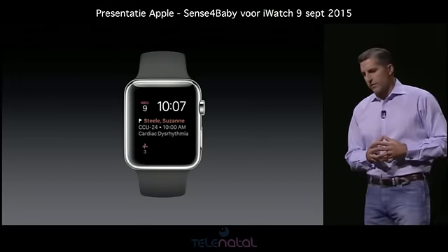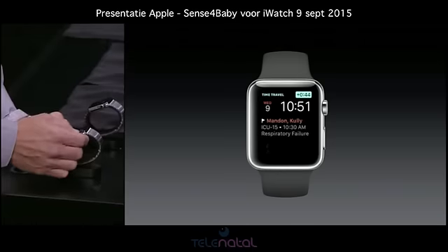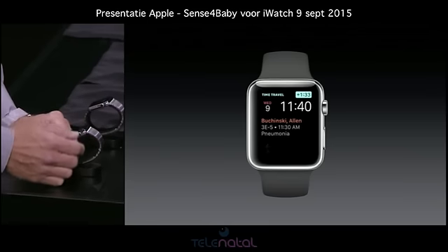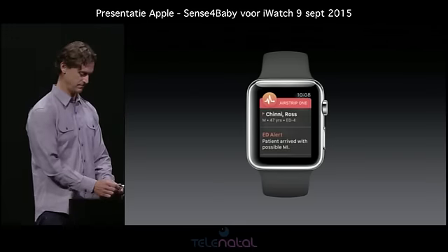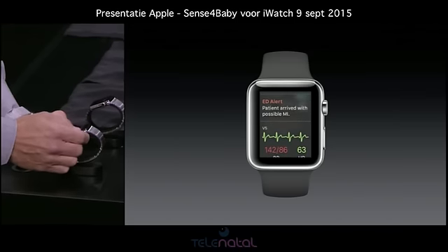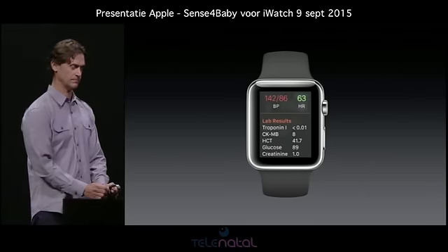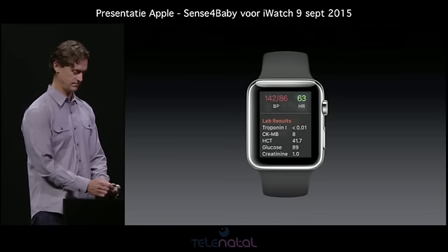Now, if I look at my watch face, I can see my next patient, I can notice their diagnosis, and I can actually time travel to see what's next. But let's see what happens if a nurse sends me a notification. Now, within the message itself, I can see the alert, the waveform snippet, vital signs, and the lab results. The reason that I can immediately see all of this relevant data is because once I have the watch on, I am securely authenticated until I take it off.